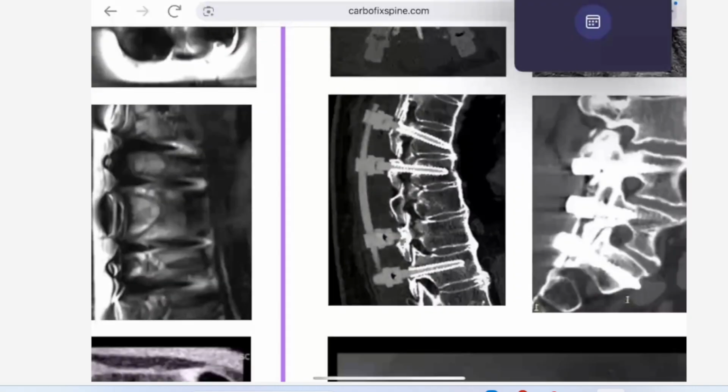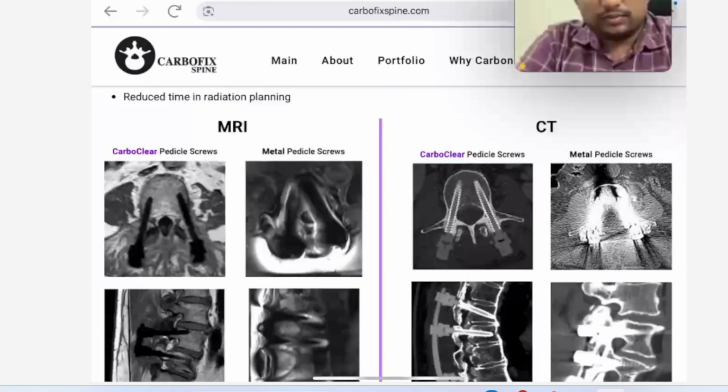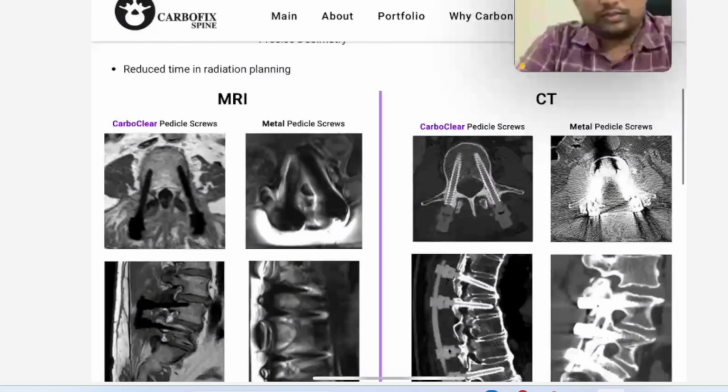So this is a spinal cord implant product which is made up of carbon fiber, but they use a different composition of material which they never disclose, as it is proprietary and they want to protect their business. But it is easily doable in India as well. For that you need a different kind of material and a different kind of research team.